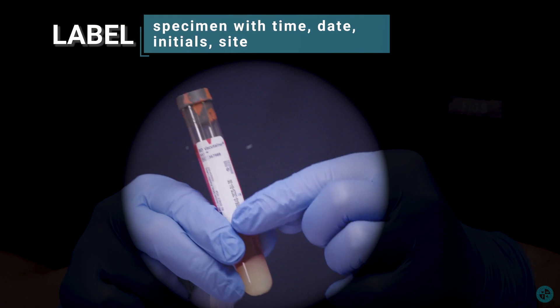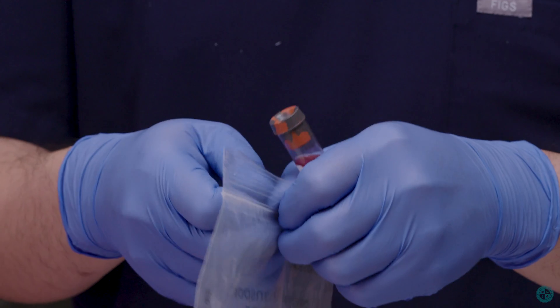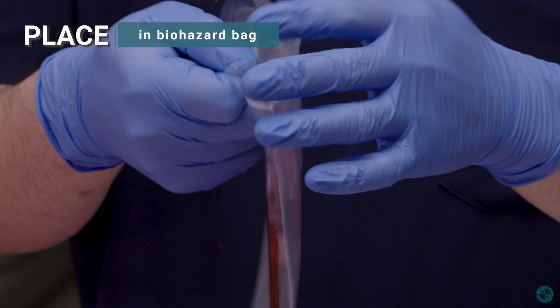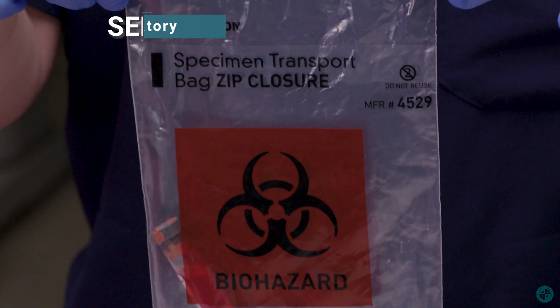Label the specimen with date, time, initials, and site. Place in biohazard bag and send to the laboratory.